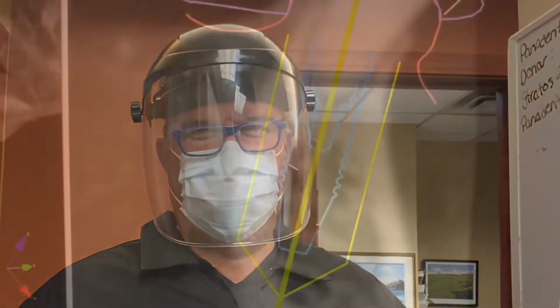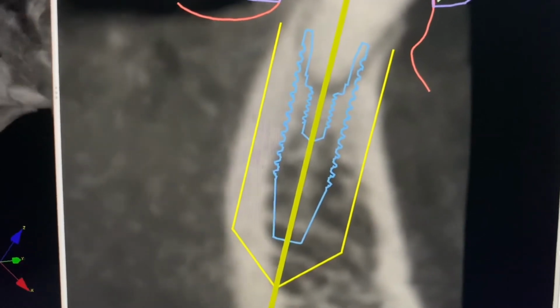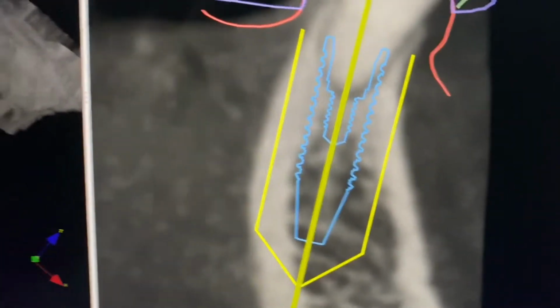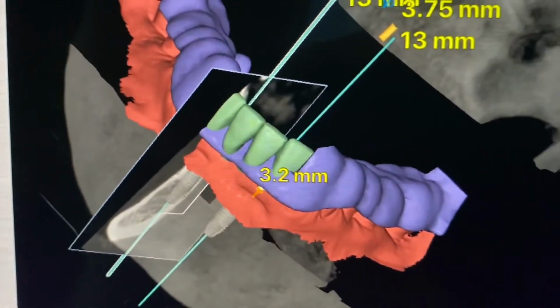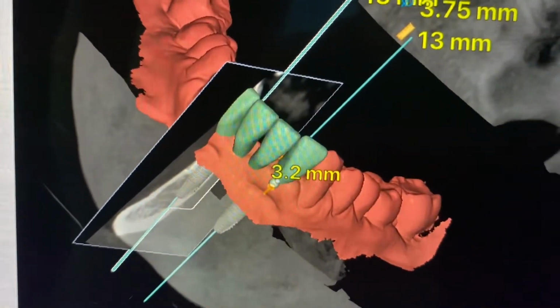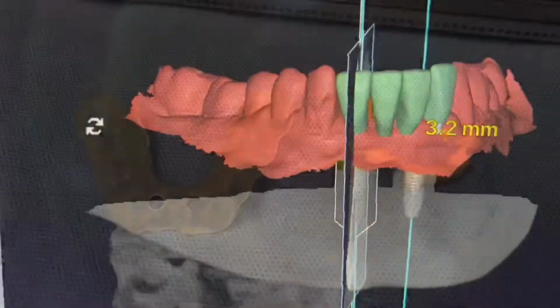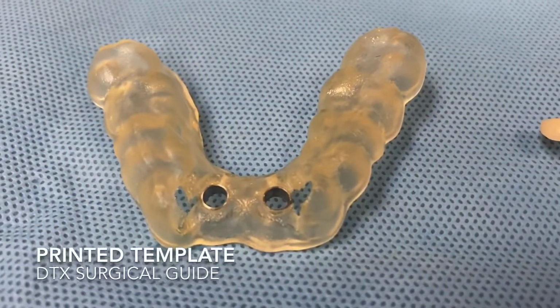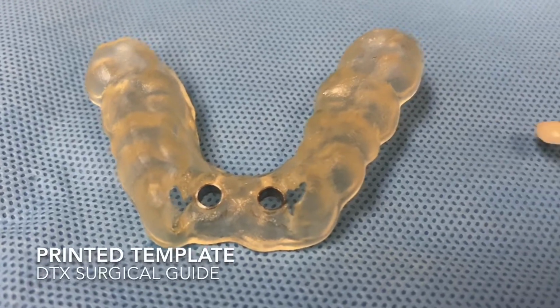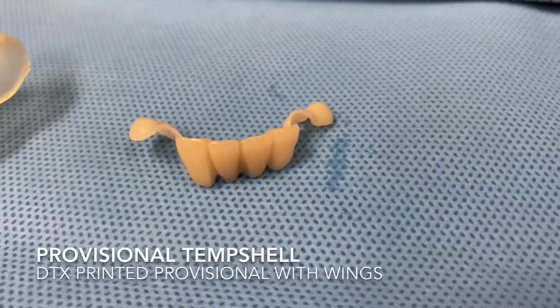We can use that resin to go inside and make this into a better position for you to use. So you see that the teeth are not really held in any bone, so we're going to have to cut that back, but we want to flatten the 2 center pontics down a little bit and not make them into tooth forms. Patients have too much of a hard time cleaning this. So we've got our template generated. We've printed this in our office. You can see it's ready to go.